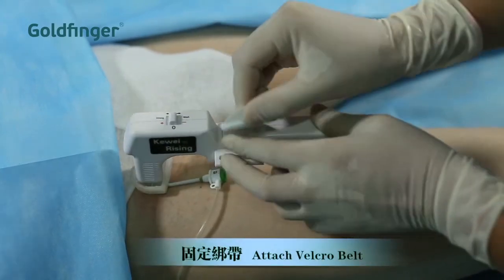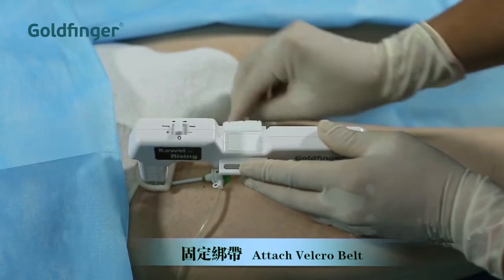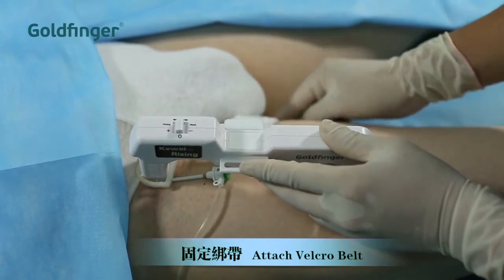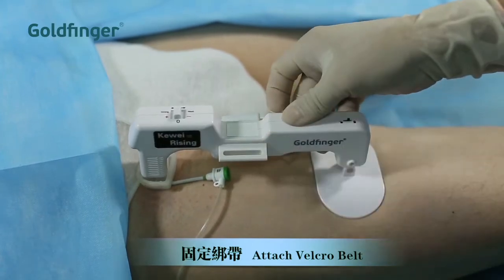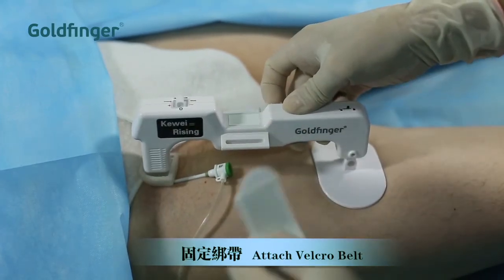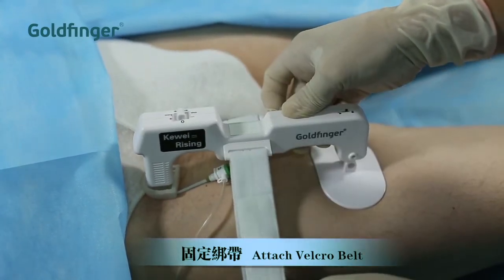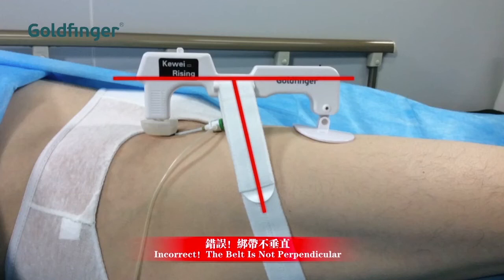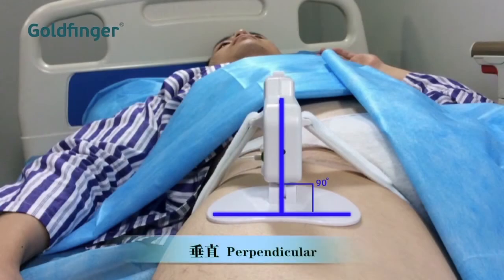Attach the Velcro belt to both sides. If the belt is too long or too short, you may refer to the adjustment instructions in the user's guide. For correct position, a side view of the belt and the main unit should form a 90 degree angle. The unit should be perpendicular to the thigh when observed from the end.